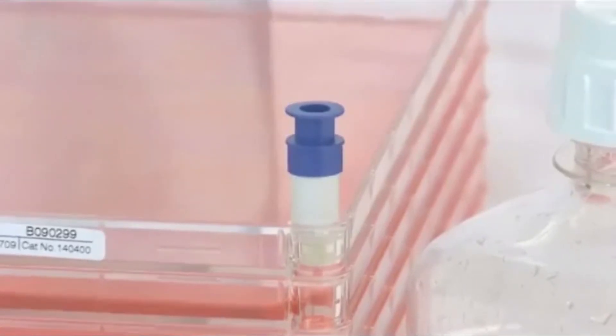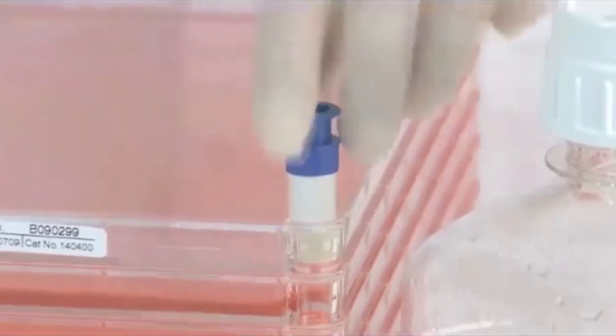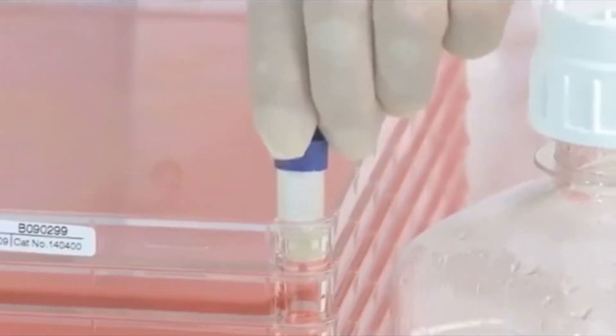To empty the EasyFill Cell Factory System through the smaller port, remove the blue cover cap and loosen the white vent cap approximately three quarters of a turn. Then simply pour the medium into the bottle.